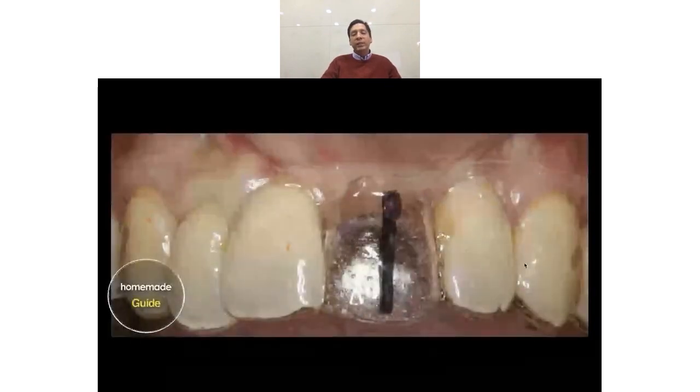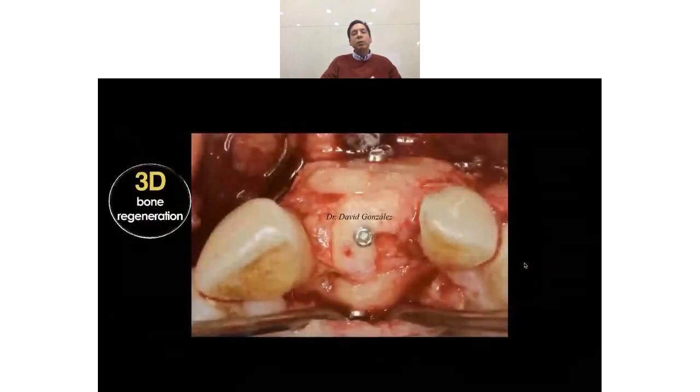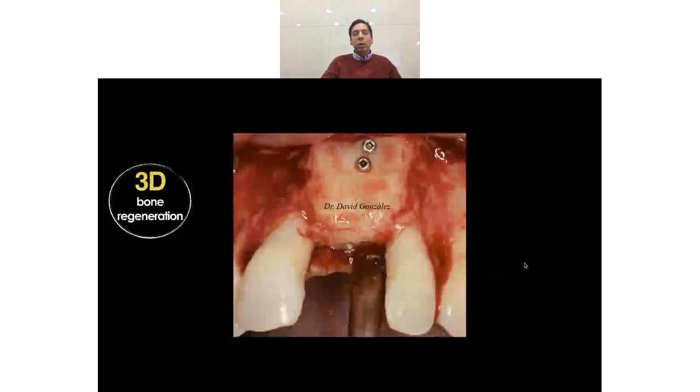So now we're going to place the implant. Placing the implant will be a very, very easy task because now we have a lot of vital, bleeding, mature, bright bone. Here we can see the bone is bleeding, it's vital, it's mature. The bone level is, in my opinion, optimal.